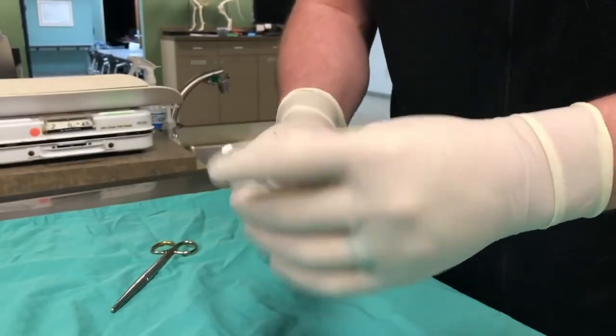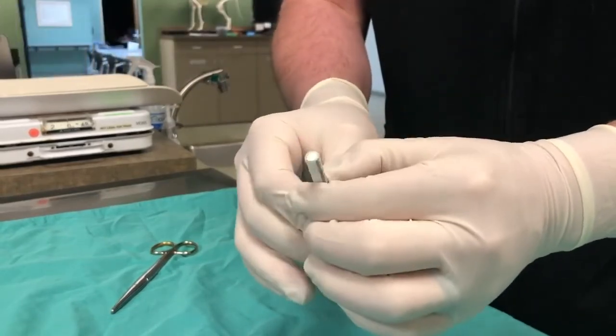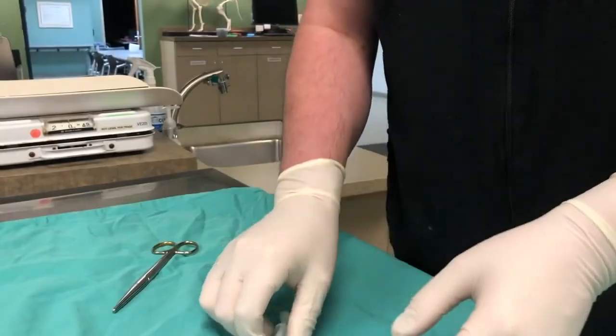As you have done this with sterile technique, you've created sterile syringes that can be used in other procedures provided sterility is maintained. This can be both life-saving and cost-effective.